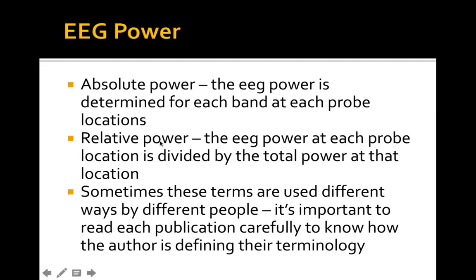This is sometimes used because in a resting state EEG, as you look across the brain, you find that there is a natural distribution of power levels.